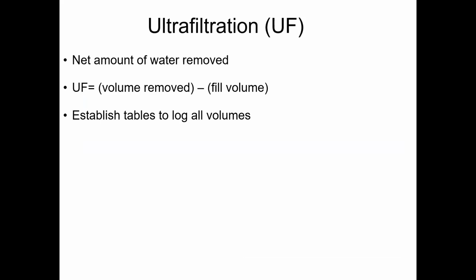Then coming to ultrafiltration, that is fluid removal. Ultrafiltration is the net amount of water removed and is calculated as the volume removed minus the fill volume. We have to establish tables to log all volumes.